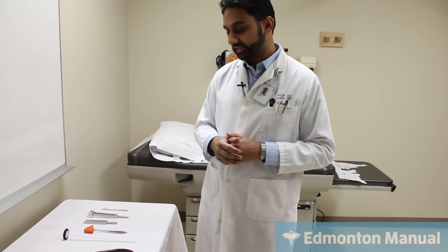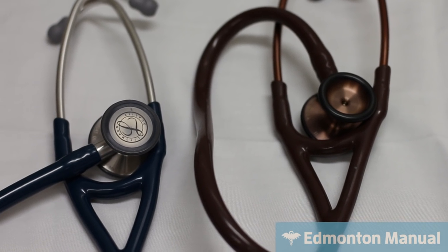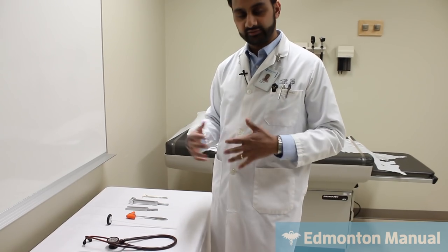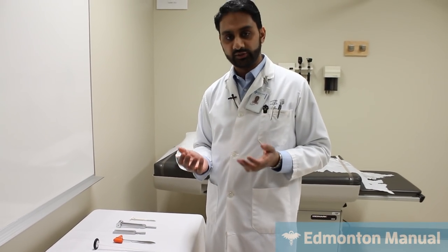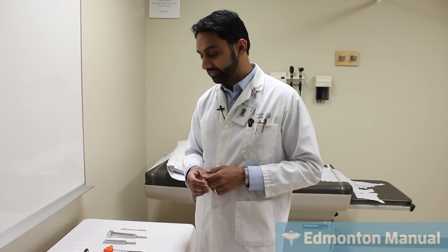A very common stethoscope we often use is the Littmann Cardiology III stethoscope. One of the things that Littmann has done to really sell their stethoscope is develop what's called tunable technology. This is very much aimed at the medical student level because it allows medical students to use the same stethoscope both in pediatrics as well as adult medicine, and have the option of both using a diaphragm and a bell.